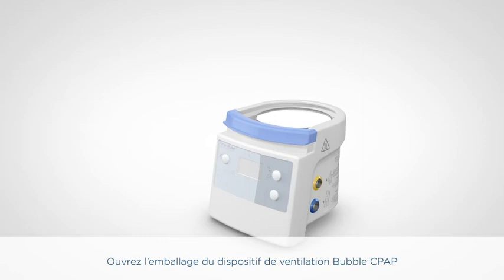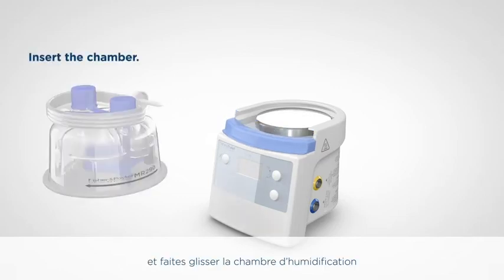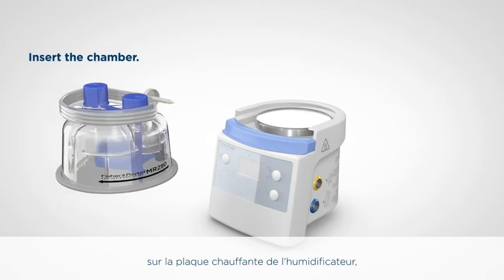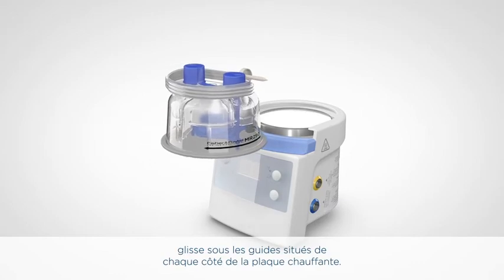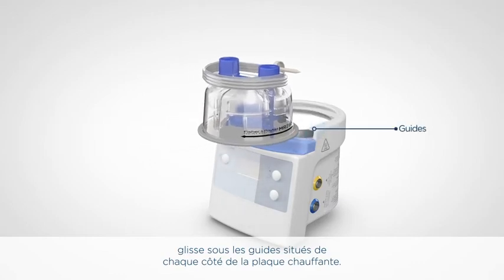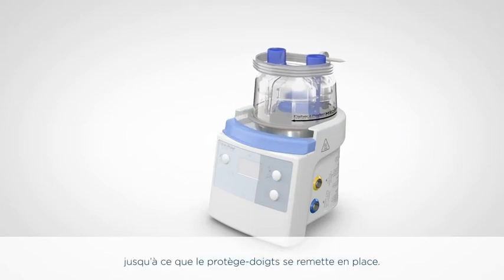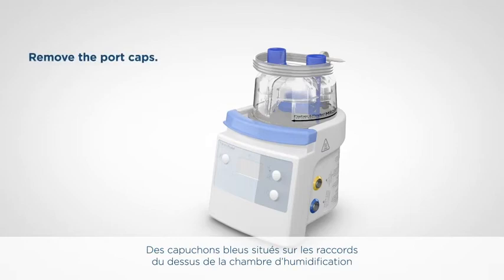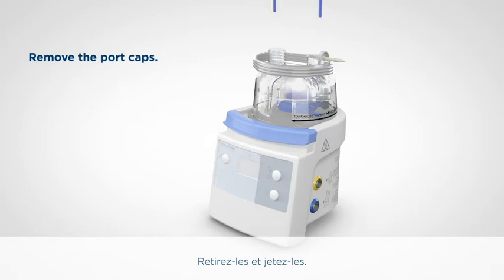Open the Bubble CPAP delivery system bag and take out the humidification chamber. Push down the finger guard and slide the humidification chamber onto the humidifier heater plate, making sure the aluminium base of the chamber slides under the guides on either side of the heater plate. The chamber should slide to the back of the heater plate until the finger guard springs back to place. There are blue port caps on the top of the chamber that hold the floats in place during transport — pull up on the ring attached to these port caps, remove and discard them.